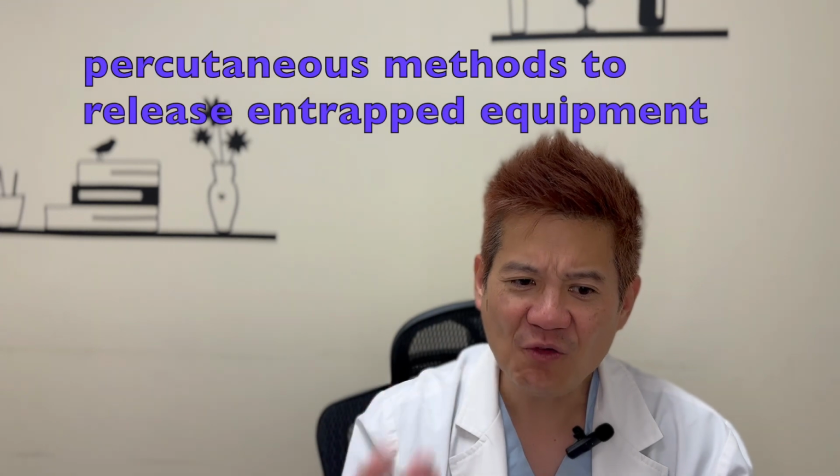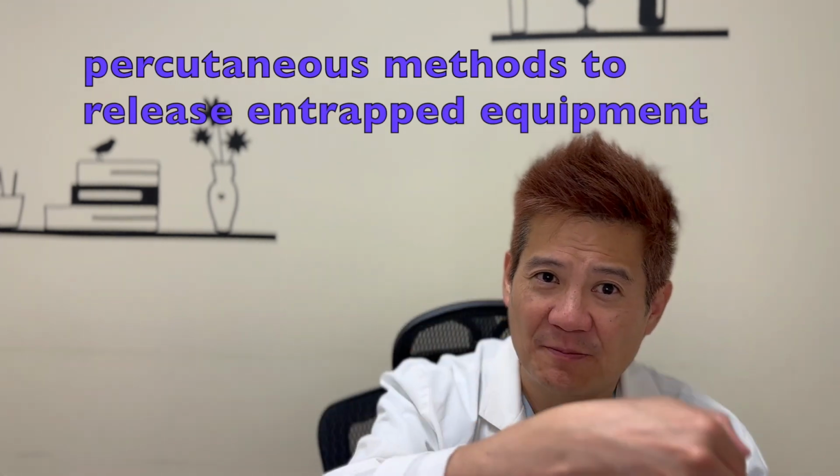Now, most cases of equipment entrapment can be sorted out percutaneously, so we should have a higher threshold to refer to the surgeons to take it out. And of course, that does happen, but we should have a higher threshold. We should try to release the equipment percutaneously. Often, advancing another wire parallel to the stuck equipment and putting a balloon down and balloon to loosen it is enough to get the equipment out.